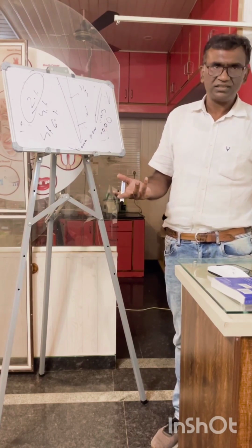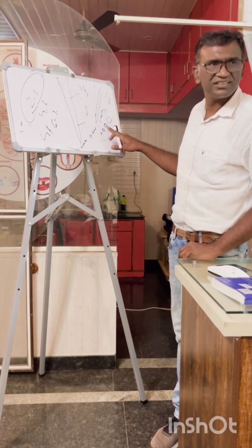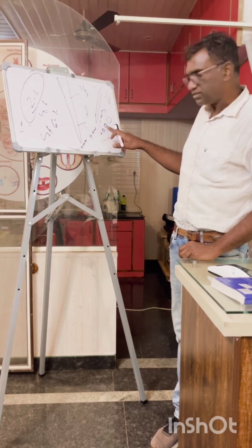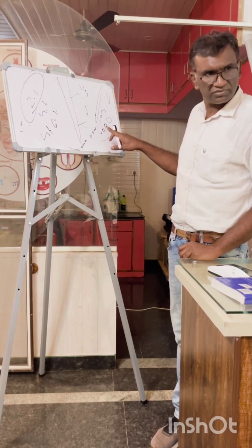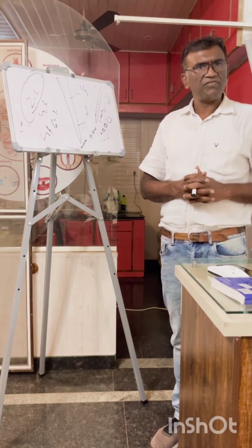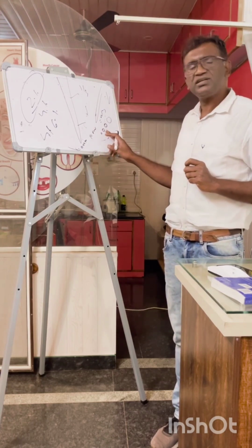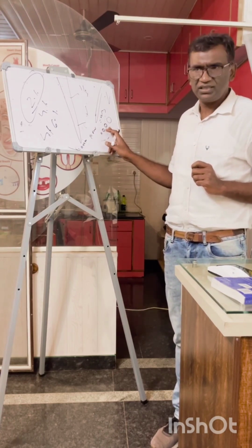Palatal canals of our upper molars are larger, because there is only one. We have to follow this taper, 6%. Distal roots of lower molars are largest. You have to keep the taper more, 6%. This is the standard.